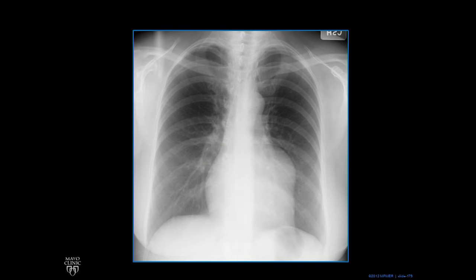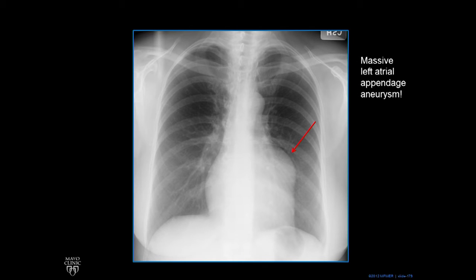Here's an abnormal radiograph. In the region of the left atrial appendage, we have a bulge. Again, that could be a mass or a lung cancer, but in this case it was a massive left atrial appendage aneurysm.